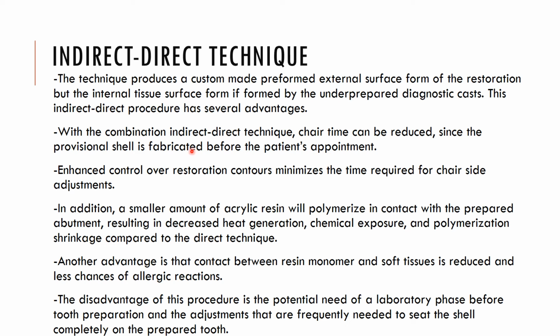With the combination of the indirect-direct technique, chair time can be reduced since the provisional shell is fabricated before the patient's appointment.